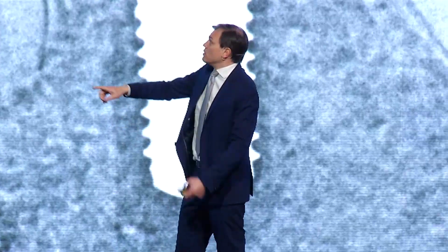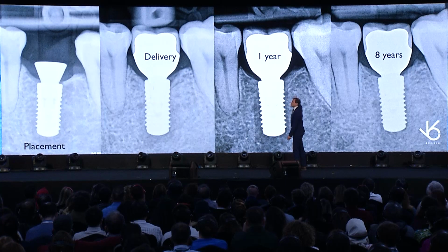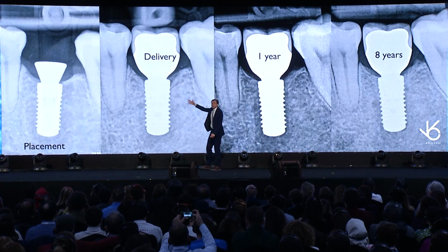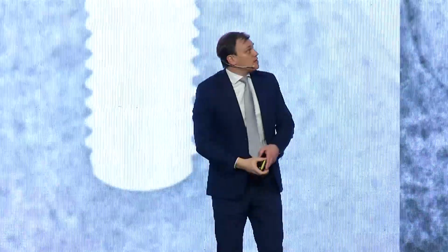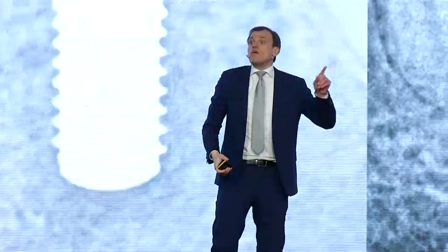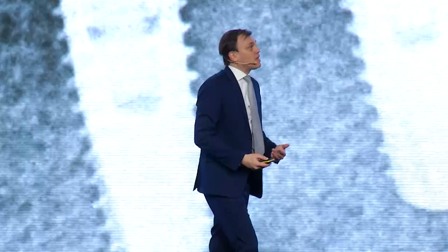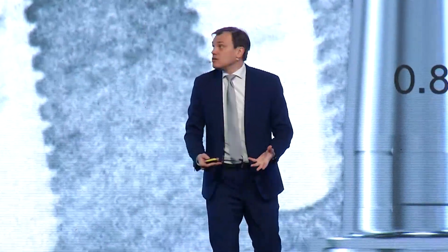So those ideas are also supported by the things we had in the past. For example, this is one of the first studies we did 10 or more years ago. In this situation, we were using provisional cylinders because Straumann did not have a variobase in 2009. And that cylinder height was 1 millimeter. So again, this is impossible if you say that tie base height must be at least 2 millimeters.